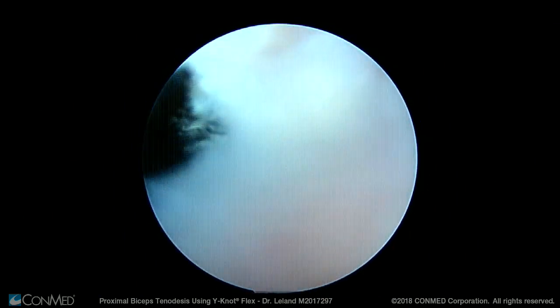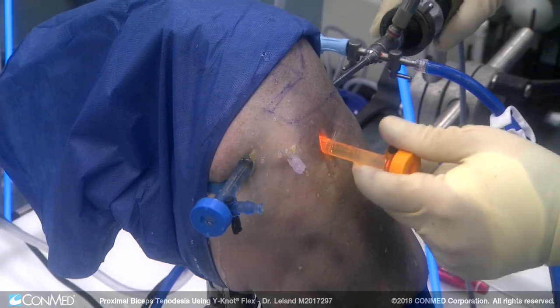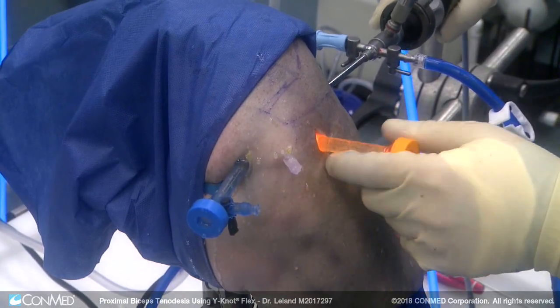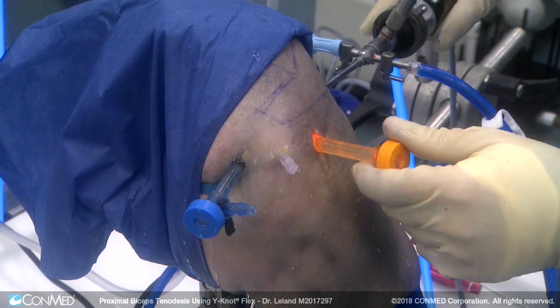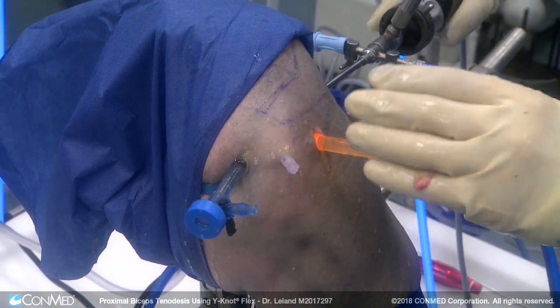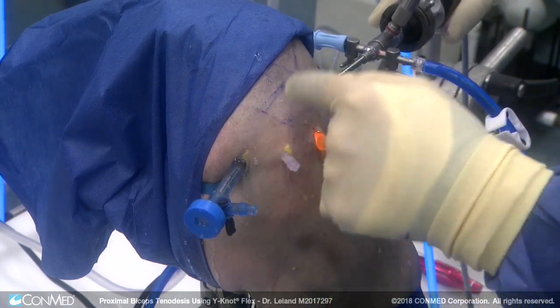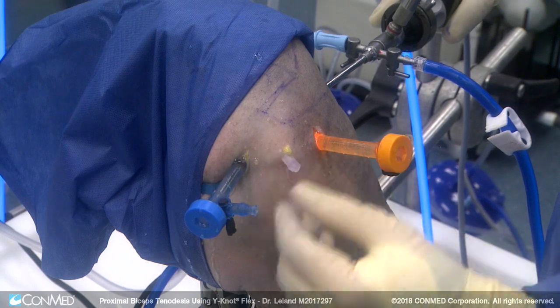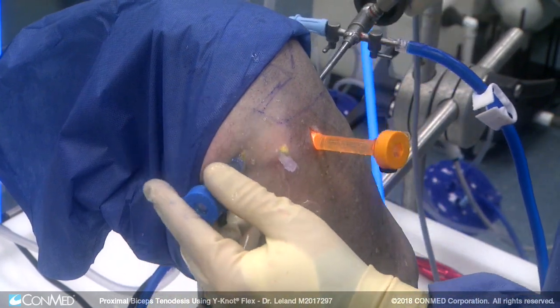We now go into the subacromial space with the scope. A straight lateral portal is created using the hex flex cannula in order to perform a subacromial decompression and a partial acromioplasty if needed to remove the anterior aspect of the acromion. We have our anterior lateral portal created when releasing the tissue over the biceps tendon, and an anterior portal reoriented into the subacromial space.